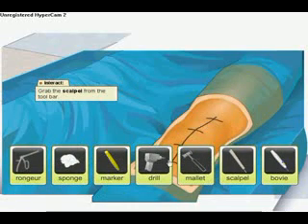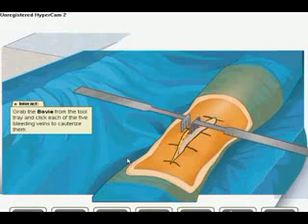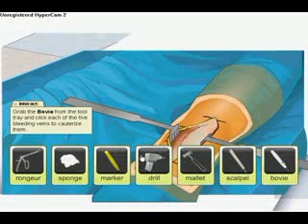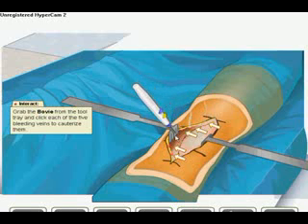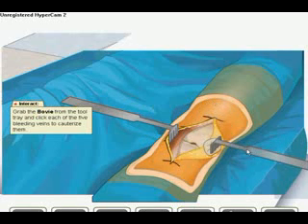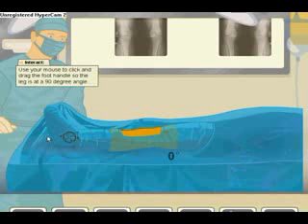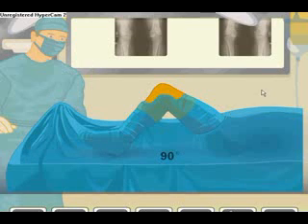Take the scalpel and cut the skin following your markings. Let's use the Bovie pencil to cauterize the veins. This will help decrease blood flow into the surgical field. The rake retractors fold the skin and tissue out of the way, exposing our patient's knee. To operate, we need the patient's knee elevated and bent so the bones are fully exposed. Now the leg is at the proper angle.